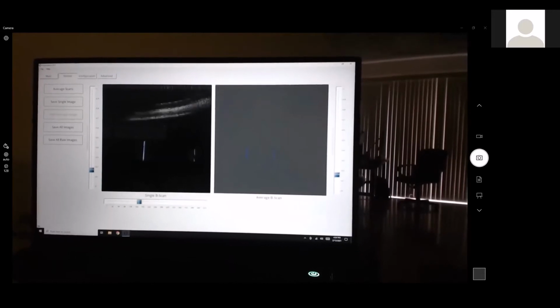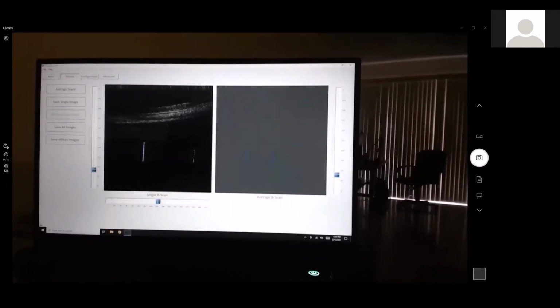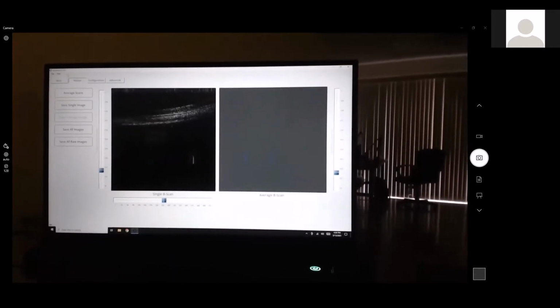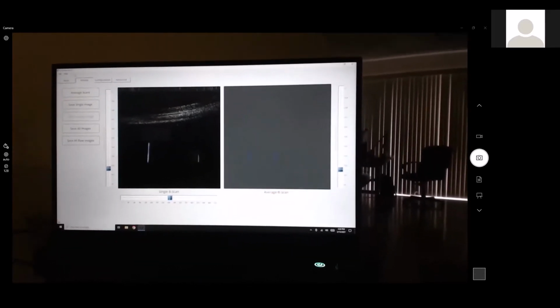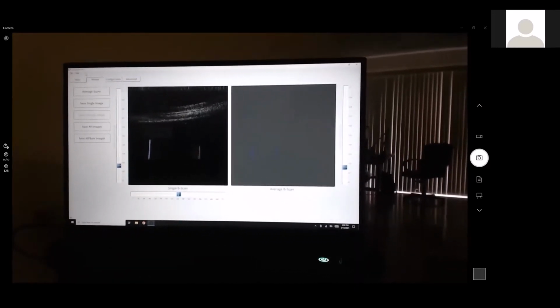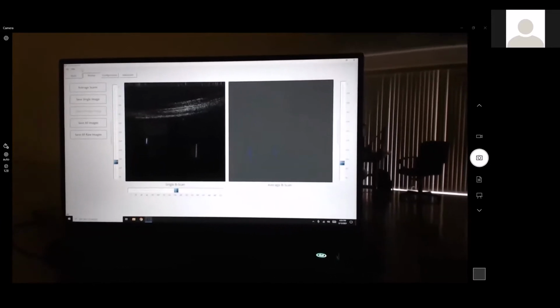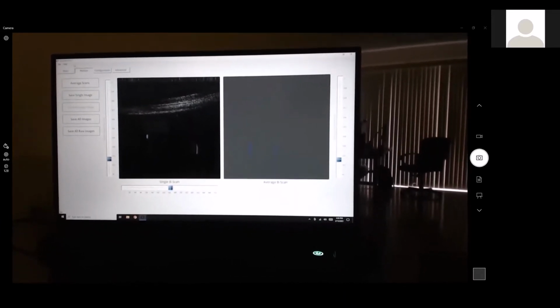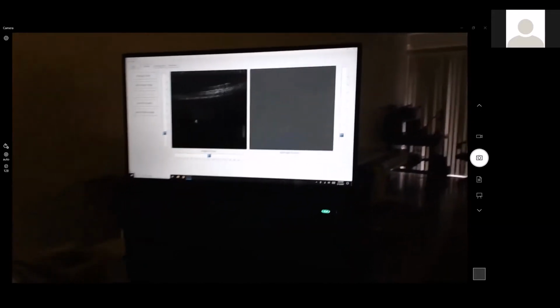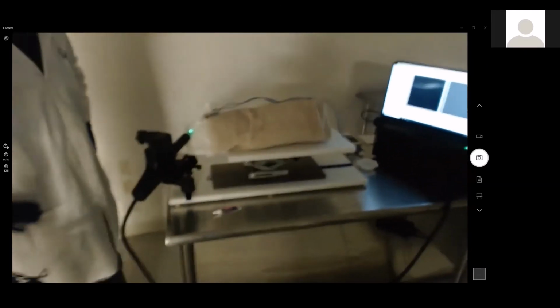So I guess what we're wanting to highlight from doing the rabbit sedated was basically how we're positioning the animal, how we're using whatever system you want to have the optics align very nicely and make it easy to see into the eye. We want to make sure that the platform and the animal and everything is very, very stable, as we've managed to do here. And then, of course, you want to be able to do your scans both for the 2Ds and the 3Ds and review your data and make sure that everything is as you expect it to be.